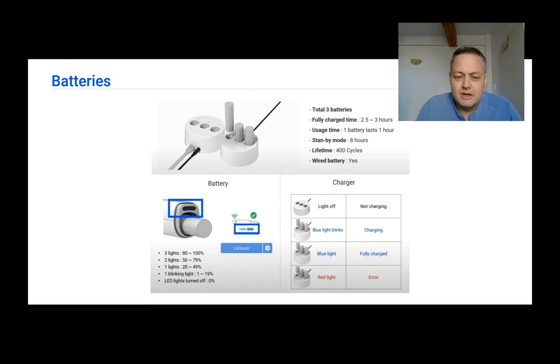The charger symbols displayed on screen show how much battery remains in each battery, so take that into account when planning your scanning sessions.